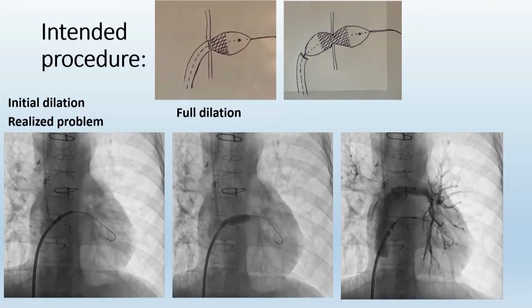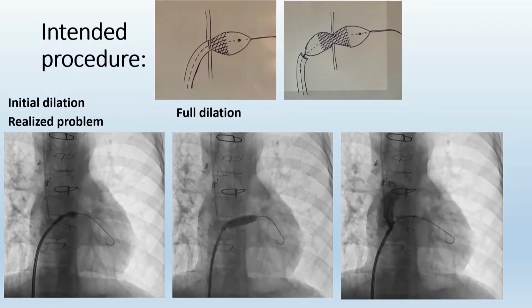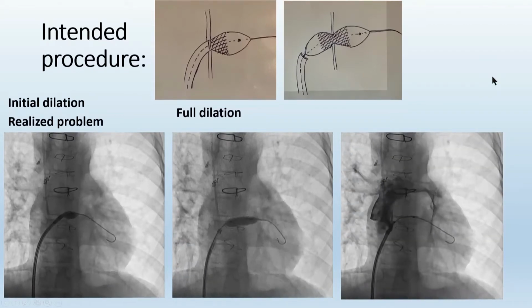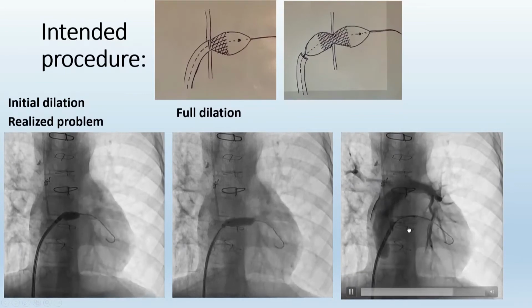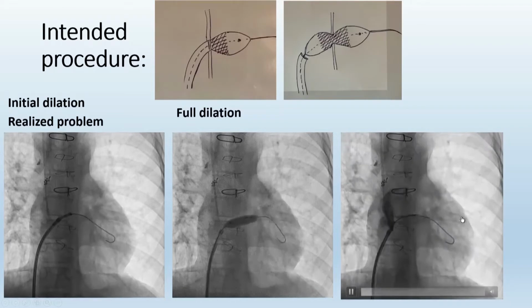So this is the full dilatation, and I always remember Frank's philosophy: any doubt, take pictures. There's no doubt actually, but I take pictures and I know the stent is already in the left atrium.